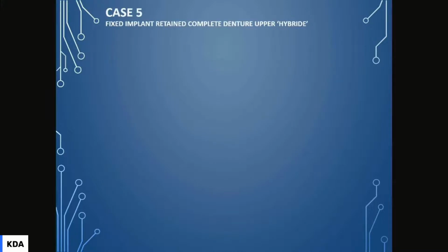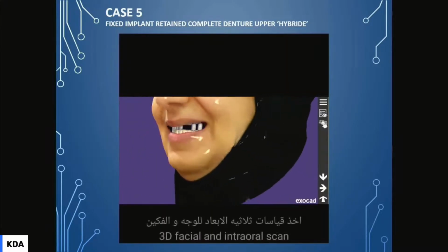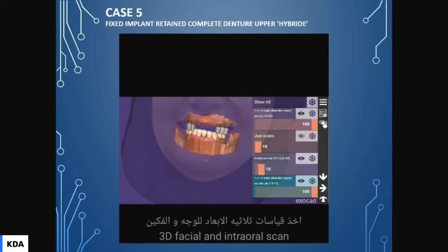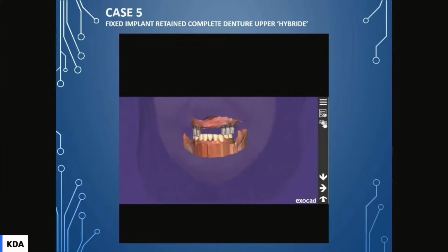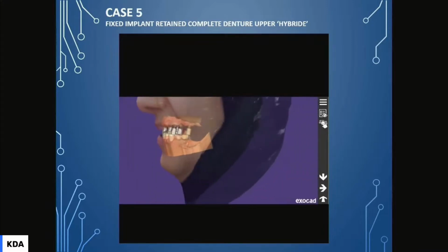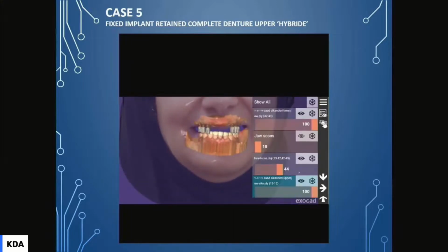Can we take it further? Yes, we can. We can not only use intraoral scanners, we can use extraoral scanners, guys. Facial scanners. And by some tools, we can align our intraoral scanner with our extraoral scanner, put them together and design the software. And we can show the patient, before we even finalize anything, the shape of the teeth, shade of the teeth, everything.